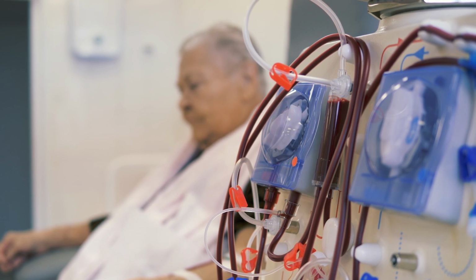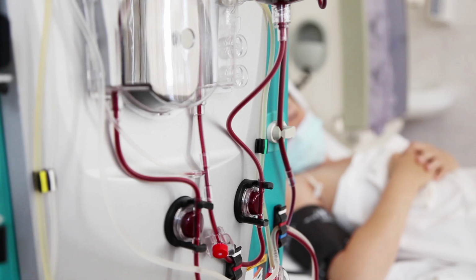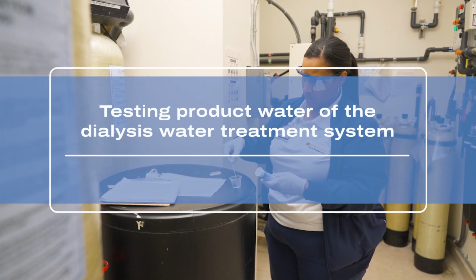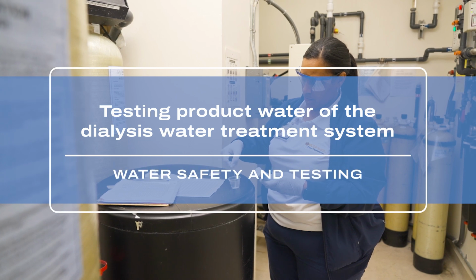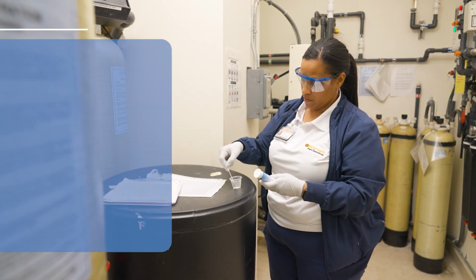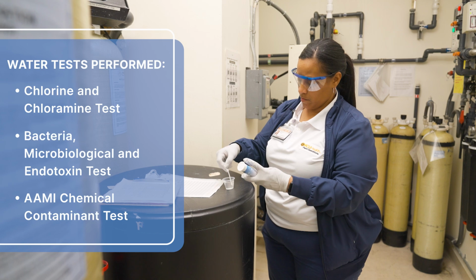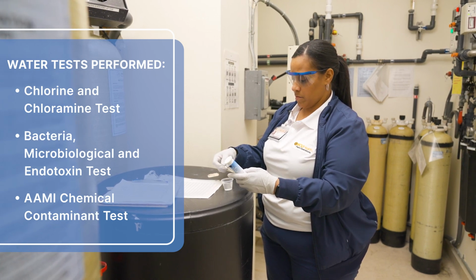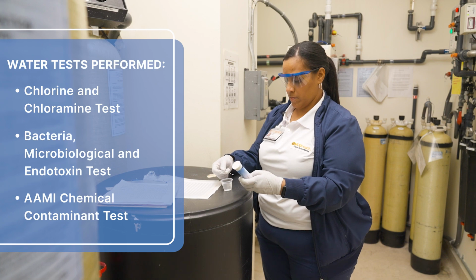To keep patients free from waterborne illnesses, frequent and proper testing and disinfection of the dialysis machines must be performed. In this video, we'll demonstrate how to properly collect samples for testing the dialysis water treatment system. The tests we'll be demonstrating are chlorine and chloramine, bacteria, microbiological and endotoxin, and an AMI chemical contaminants test.